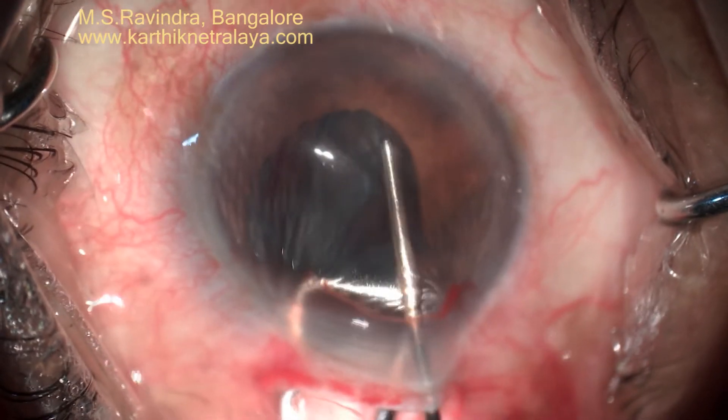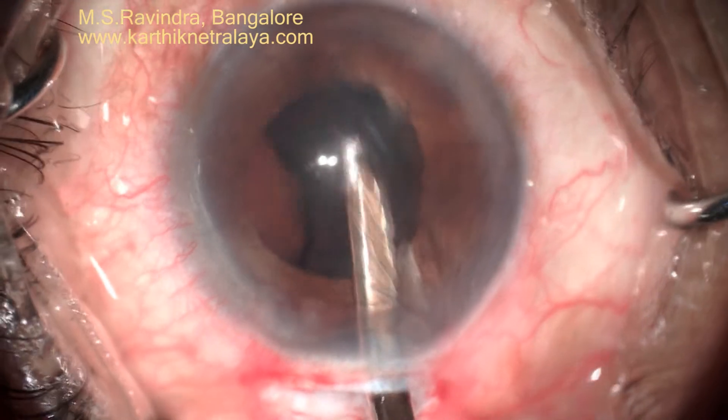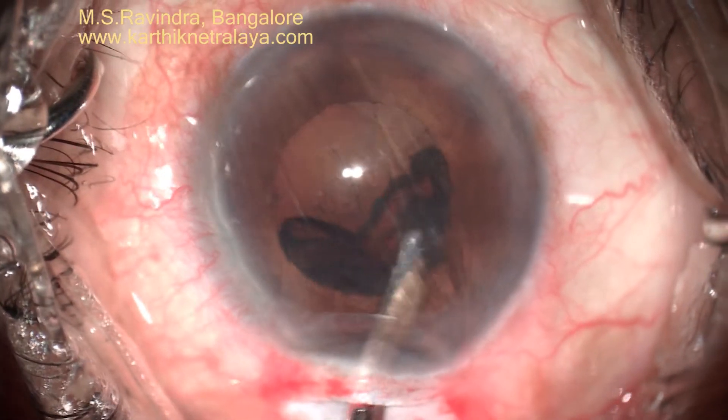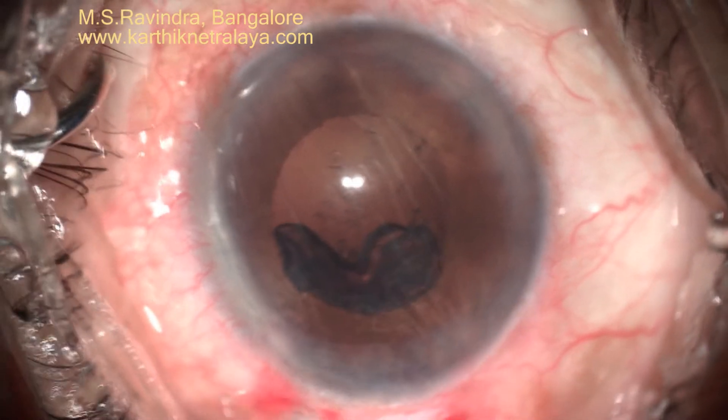The epinuclear pieces are extracted by visco expression. Cortical aspiration is extremely easy because of the hydrodesection that separated the cortex from the capsule.